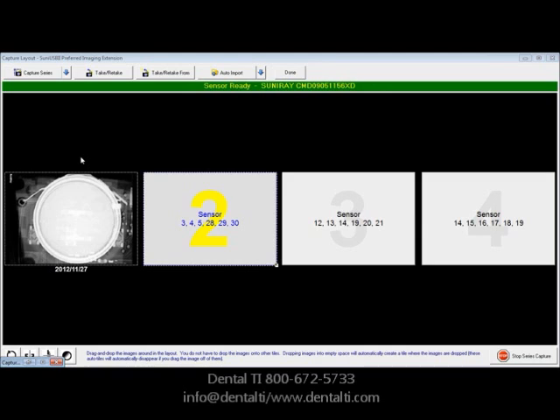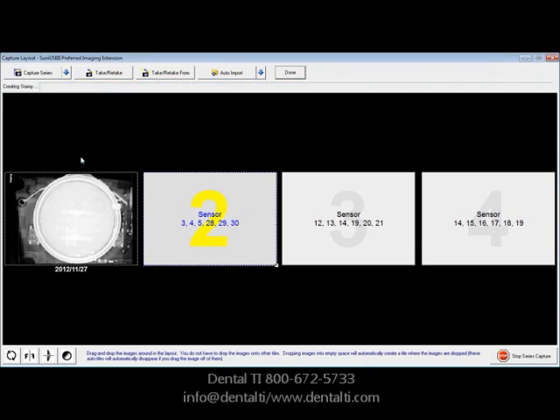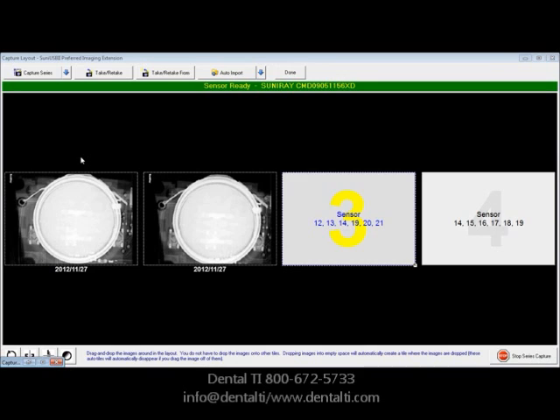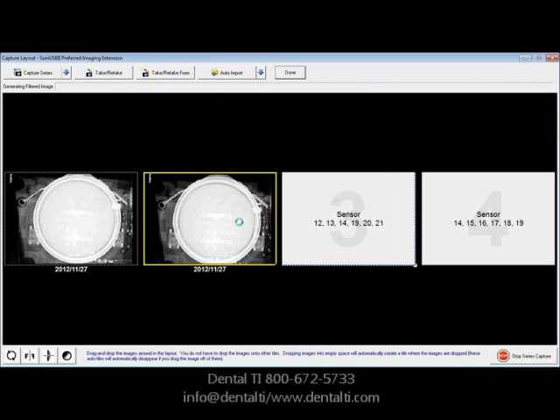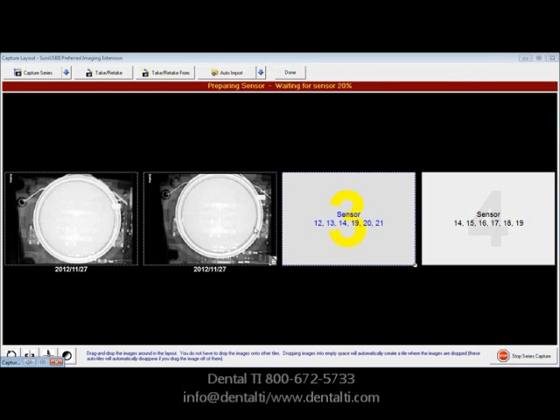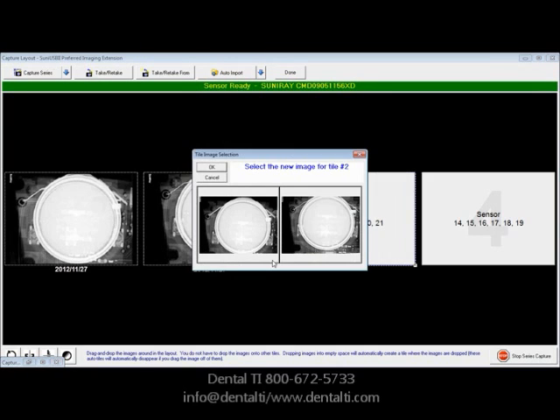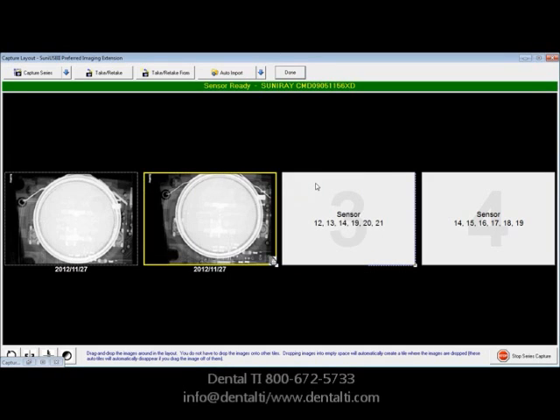Sensor ready. We'll take another image here. It exposes the image and moves on to position number three. If you didn't like number two and wanted to retake it, simply click the tile — you'll see it's highlighted in yellow — and then you can take the exposure again. What happens is the two images are stacked in the tile; they're both there and available. Simply click to see both images and choose whichever one you want on top. After stacking, the software has actually moved on to position number three.